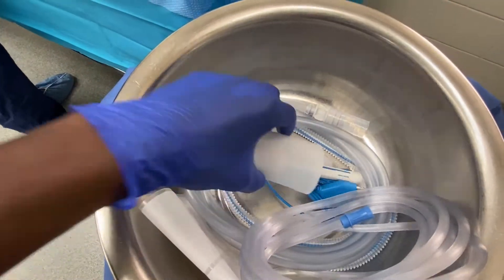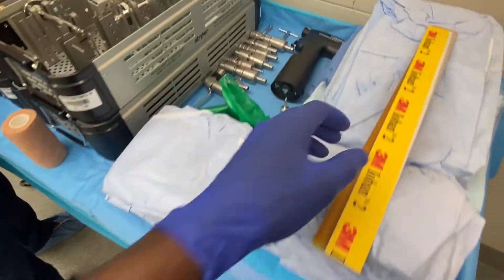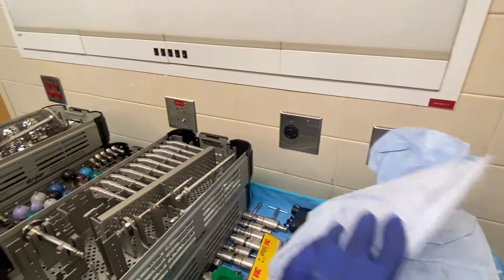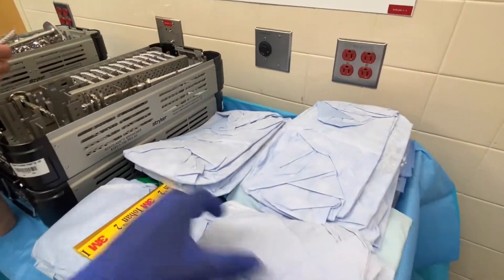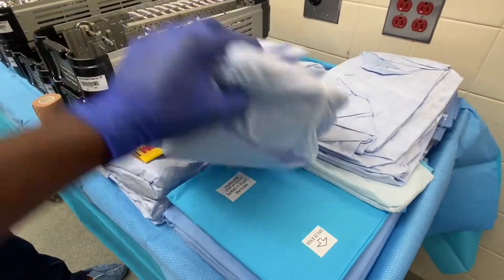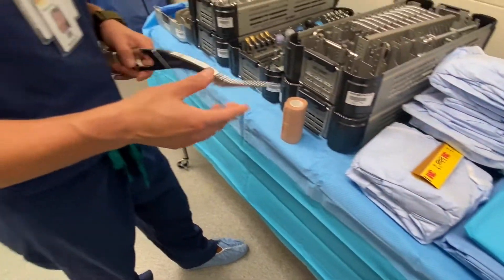Let me show you a couple more things we have here. We have a Bovie, a suction. These are the shields that we use when we put on the hoods for orthopedic surgery. These are the surgical gowns and these are the drapes that we use.